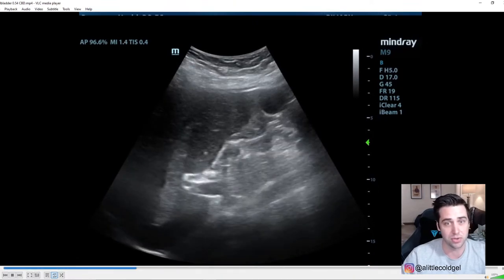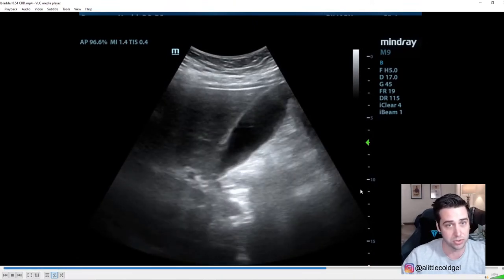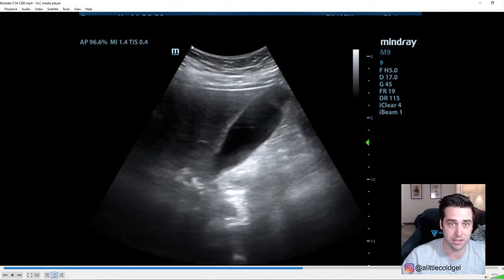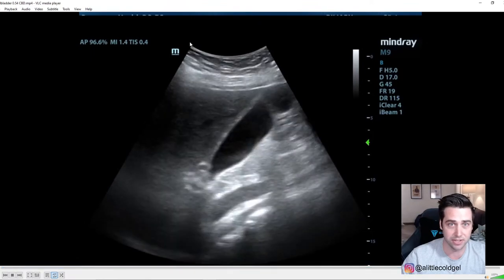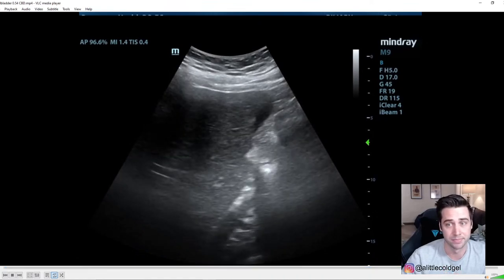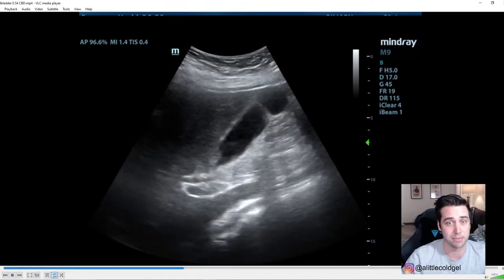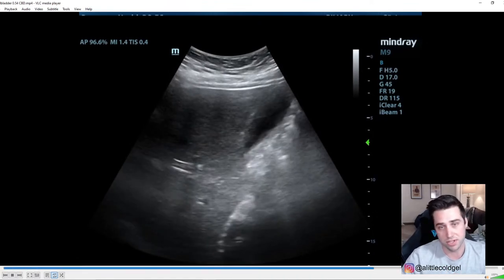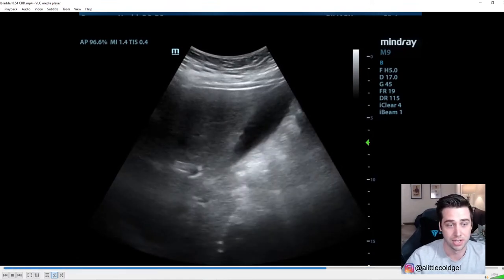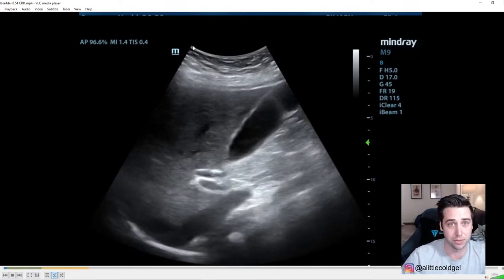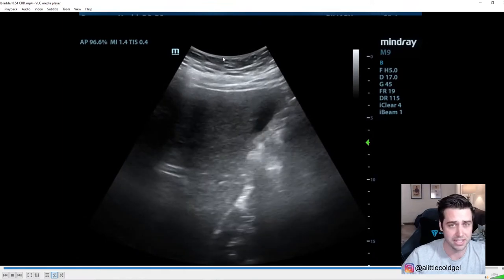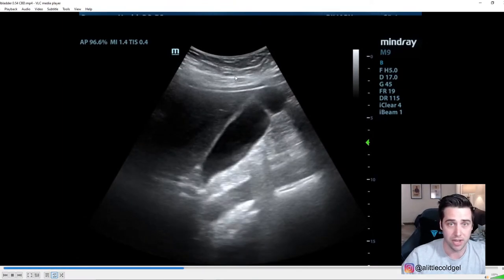A key thing you should always do whenever you're going over any ultrasound images is to look at what probe is being used. Right up here at the top of the image you can see this little curved thing — that's the probe footprint. When it's curved like that, it means it's the curvilinear probe. Curvilinear probes are usually used for abdominal stuff; you can use it for MSK, but it's not typically used for cardiac or soft tissue.